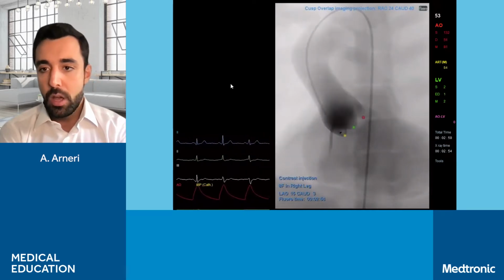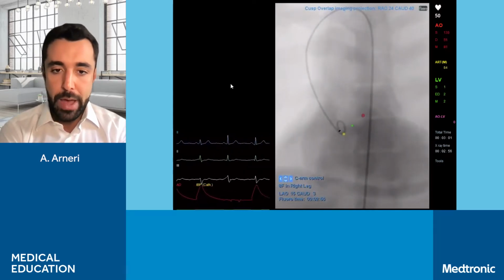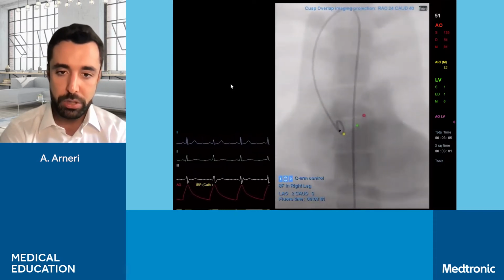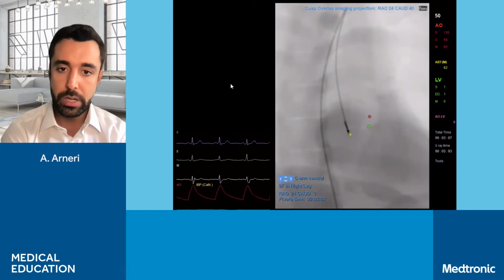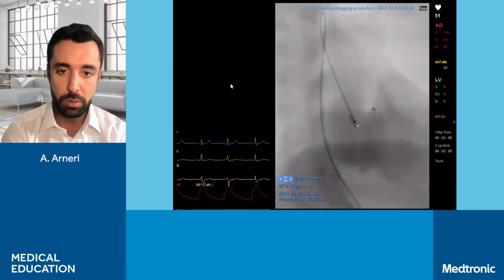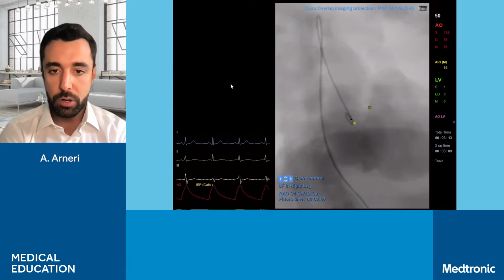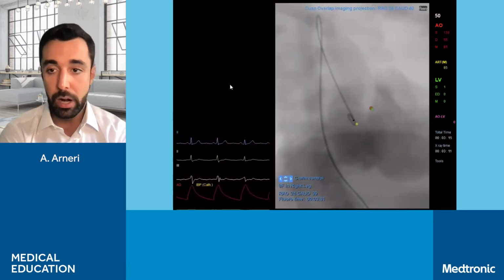Okay, so now we are going back to the cusp overlap view. That's our starting implant projection. We're gonna see what this three-cusp view will be used for afterwards. And now what we have to do, of course, is crossing our aortic valve.